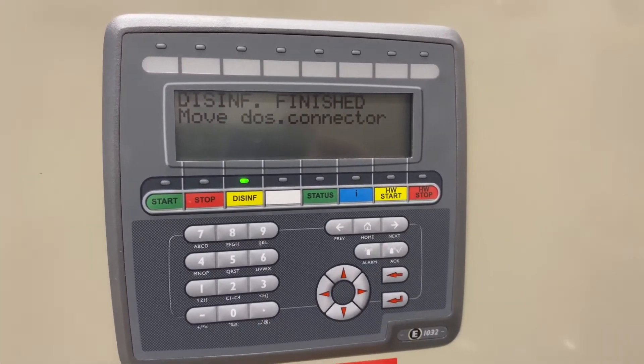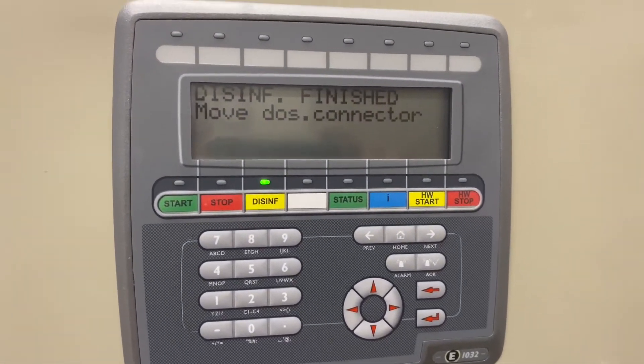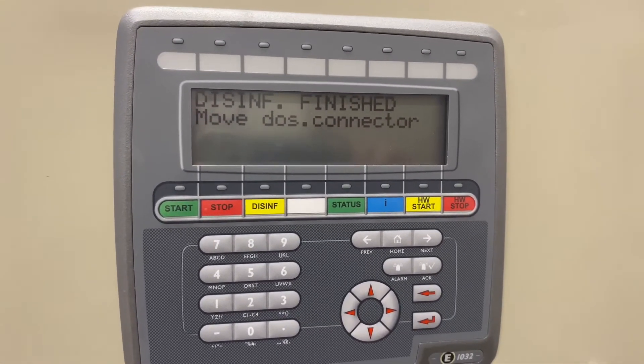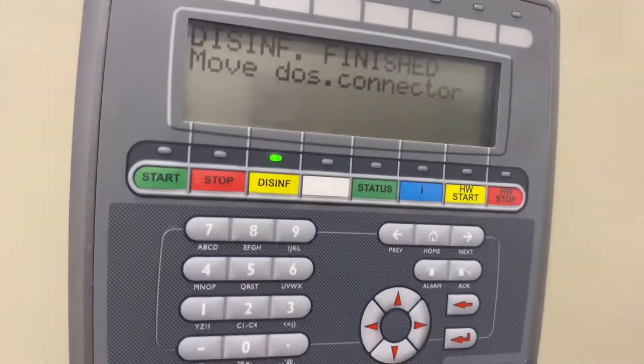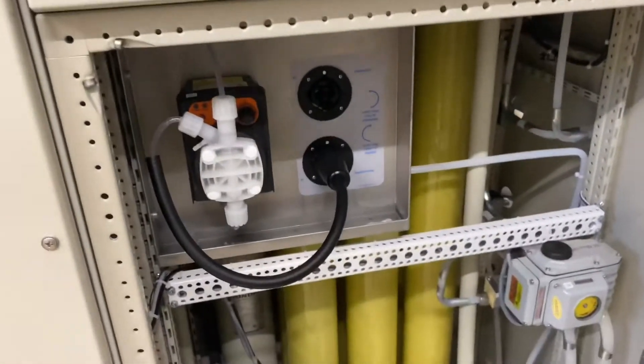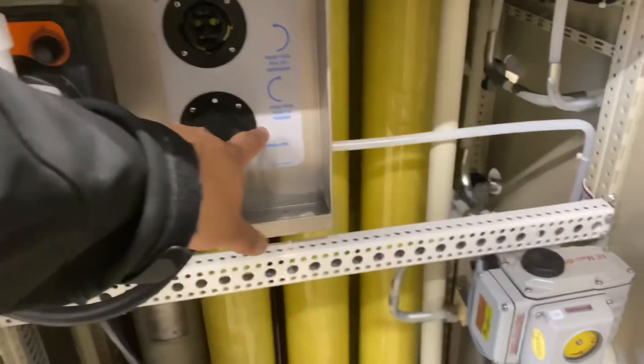Taking the RO system out of disinfect: you come in, disinfect is finished. Move this connector — it's a blinking white light on top. It's a dose connector, so you go to the dose connector. That's our dose connector — move it to this one here.